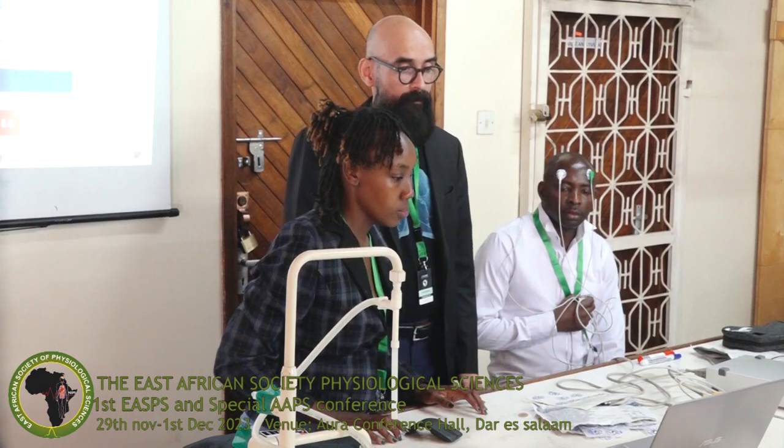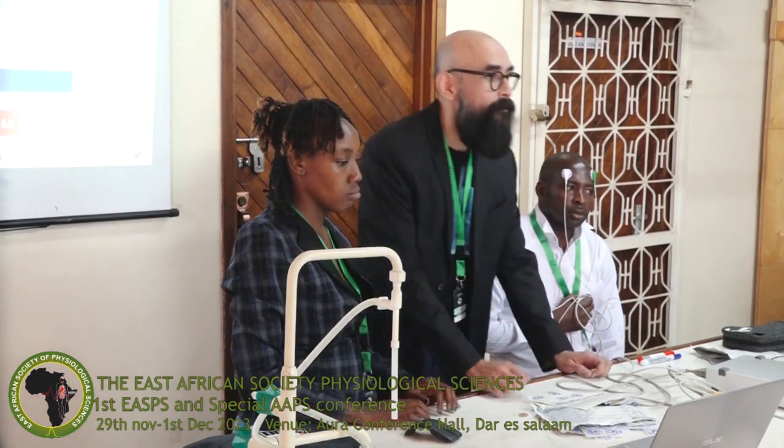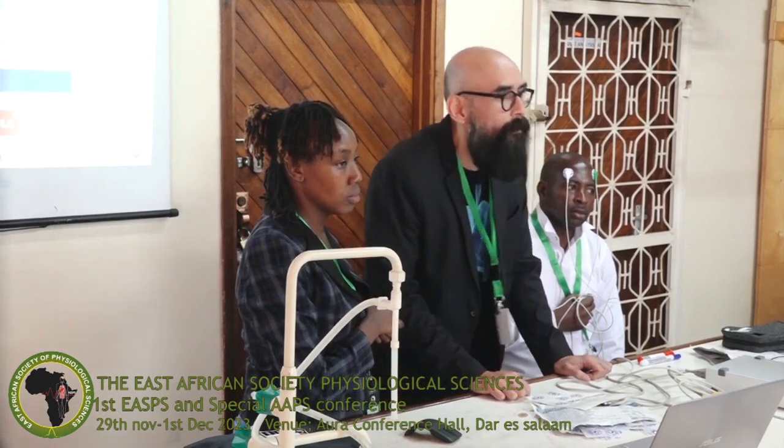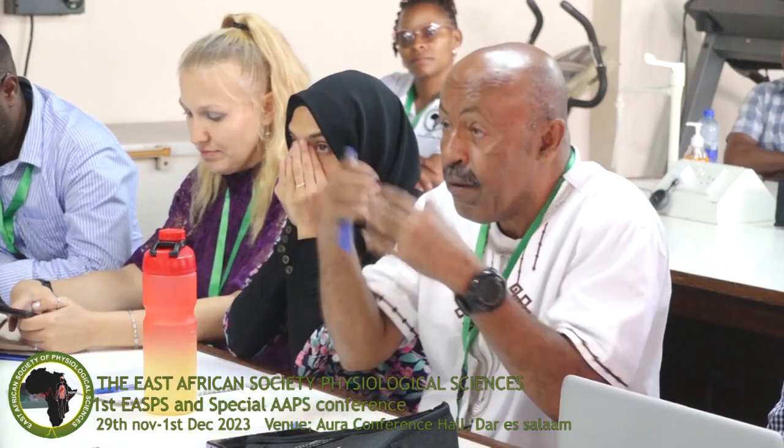All right. Any questions, guys? The visual system alone may not be enough because when this one, it totally behaves as if he's opening his eyes, and that is why we are not seeing the alpha wave correctly, because of the sound effect. It behaves as if he's opening his eyes, because the brain functions essentially similarly when there is auditory and when there is visual input. That's correct. So it's part of the elements that later on are covered in the experiment for them to see what happens when you open your eyes and when you close your eyes.